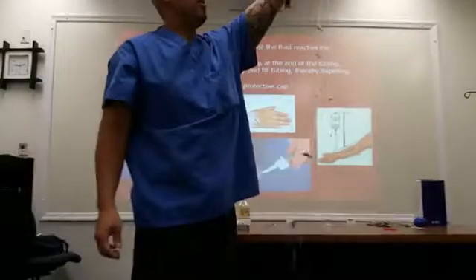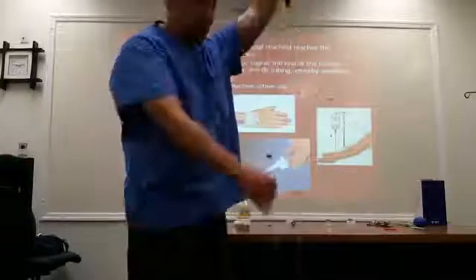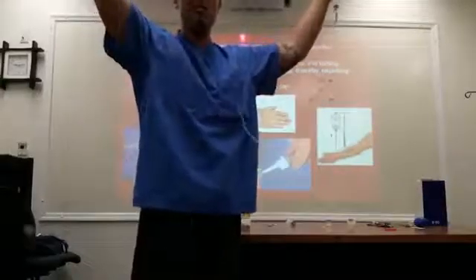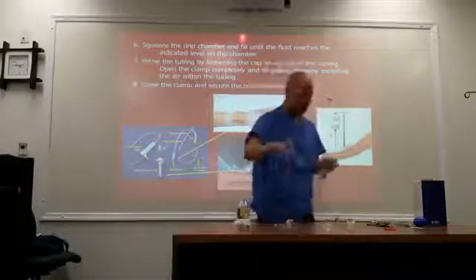All right, there's a lot of floaties in here, by the way. Am I going to put this in my patient? No. So this line, does it have air? It does have air, right? So we need to purge the air out before we connect this to our patient.